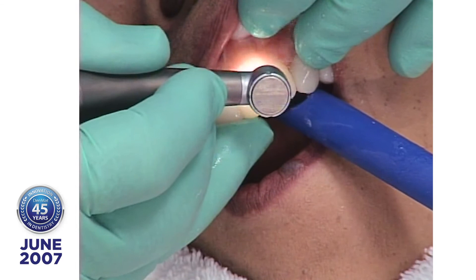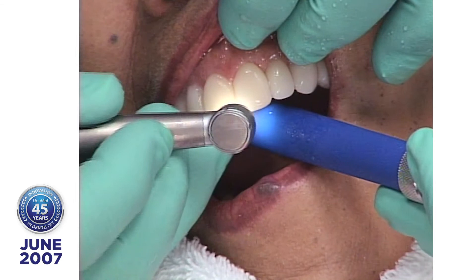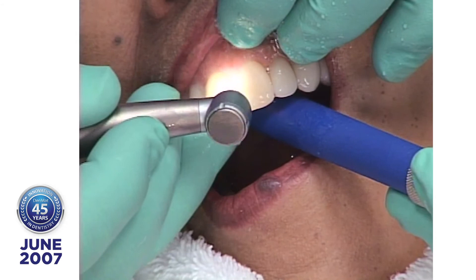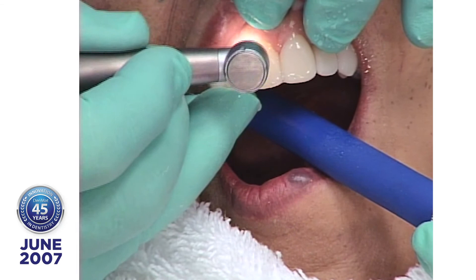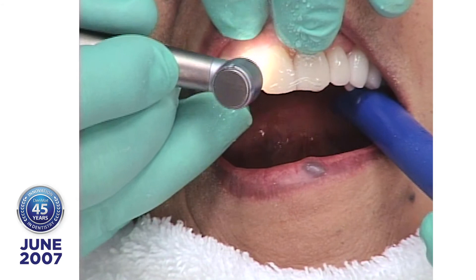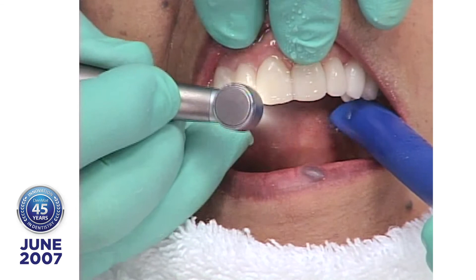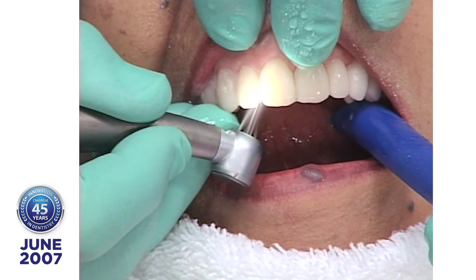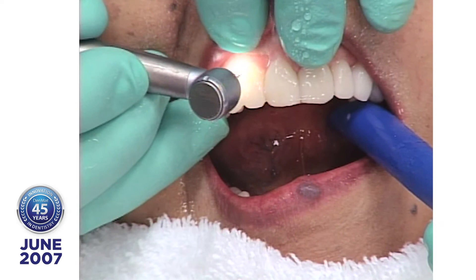Because I have four power, there's very little bleeding. We just go around here pretending like these are children's coloring books and you want to stay within the lines — we're removing the Ultrabond from the interproximals. I'm also blending the porcelain with the tooth so it fades into the tooth the same way that enamel blends with dentin.